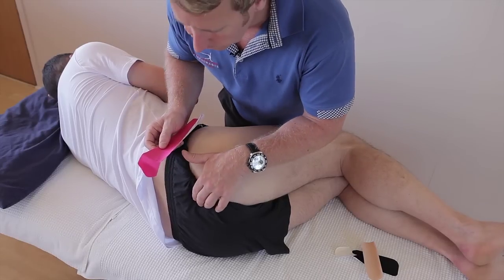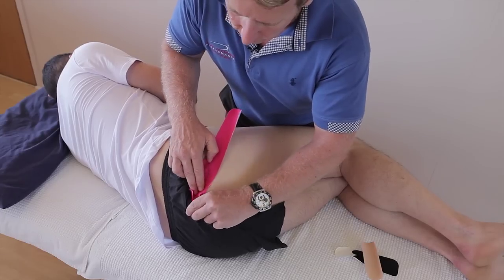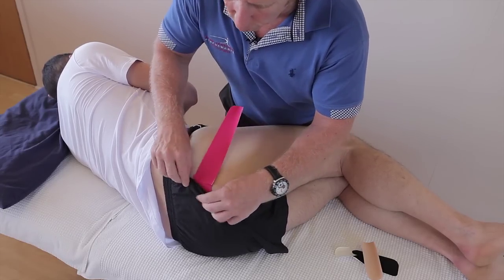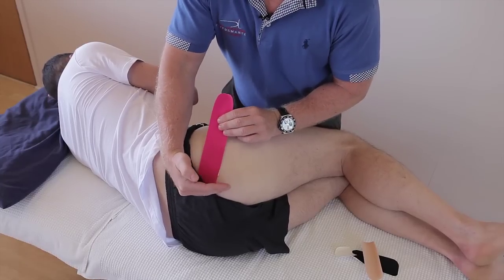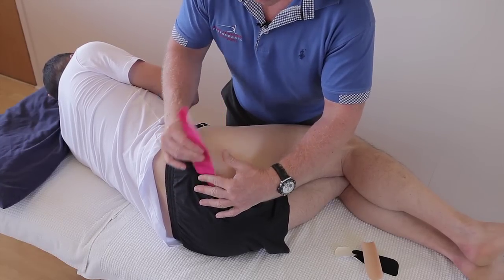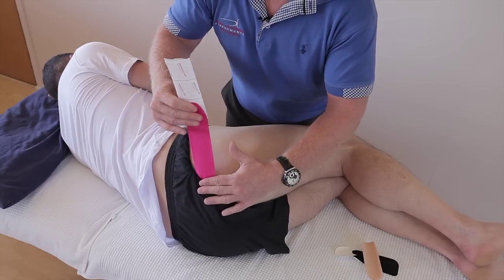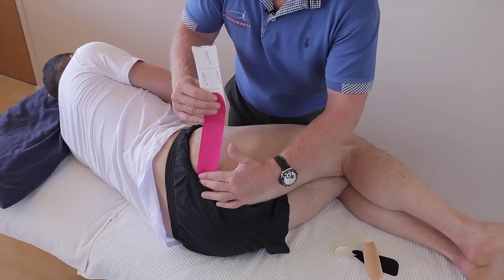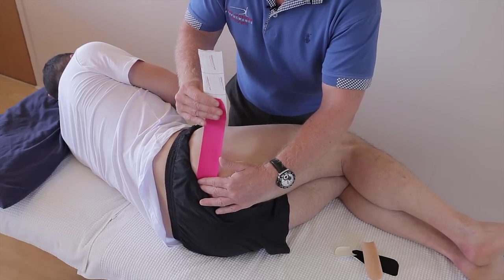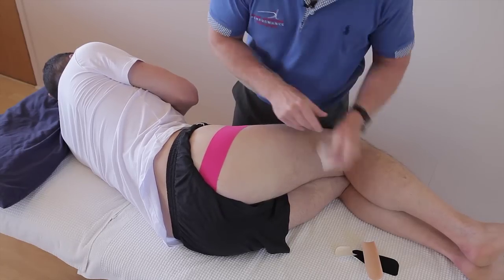The piriformis actually comes from the anterior surface of the sacrum, from S2 to S4, so we have to go as far as realistic. From there, lock it down, split the tape so you can peel it back, and apply with little to no stretch. The greater trochanter is where these muscles insert, so lock that down and cross the area with about 25% stretch.